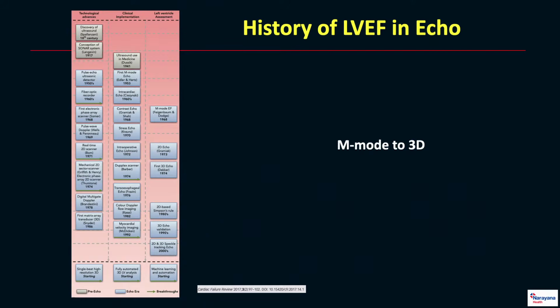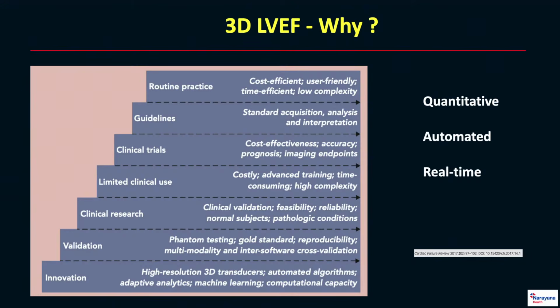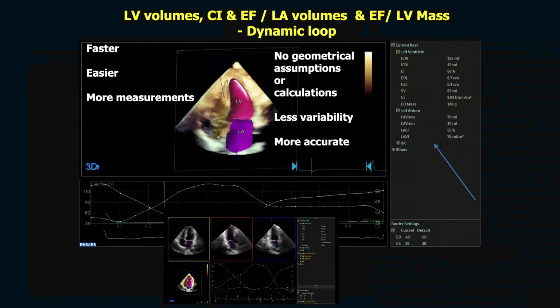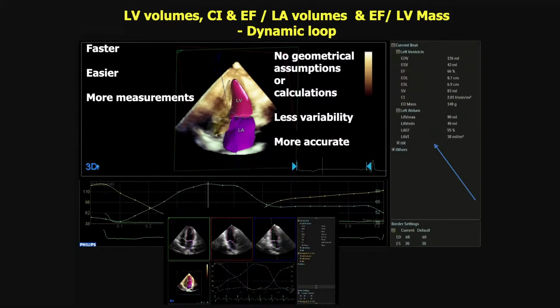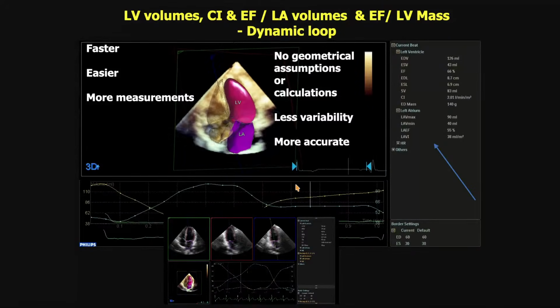And what are the various ways of looking at it? In terms of the EF, very widely used. First thing is know how to do the 3D EF. That's the most basic of all, and it is now very much recommended that you utilize it. There are various ways to do it, and as long as the image is good, the output is going to be accurate, and the less time you spend on doing adjustments, the more accurate it is going to be. Unless there's some gross change and gross corrections, try not to do fine corrections.